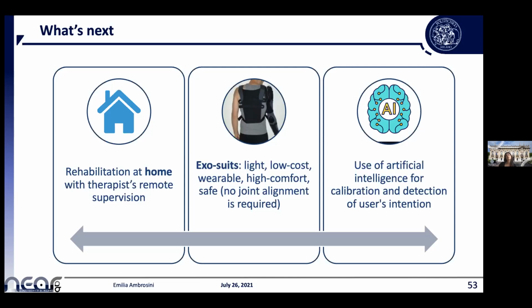Yes, I definitely think that surface EMG can be used to assess the efficacy of FES. I've also done some studies in which we evaluated EMG before and after FES. I don't know if this is what is included in this question, but usually EMG could be used to evaluate motor coordination, the timing and coordination of the execution of the task.